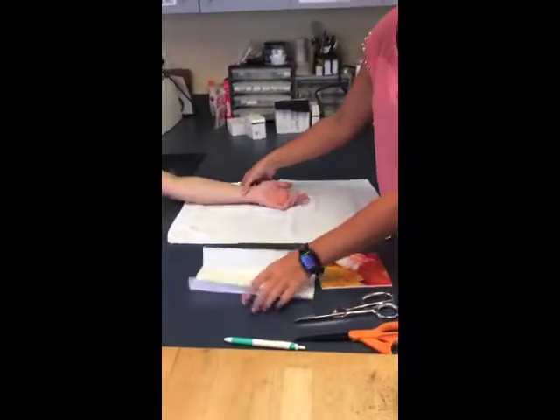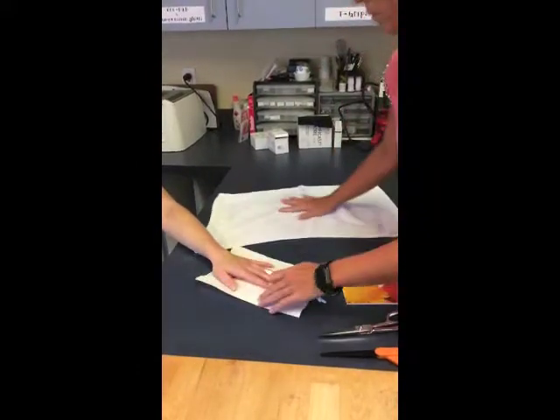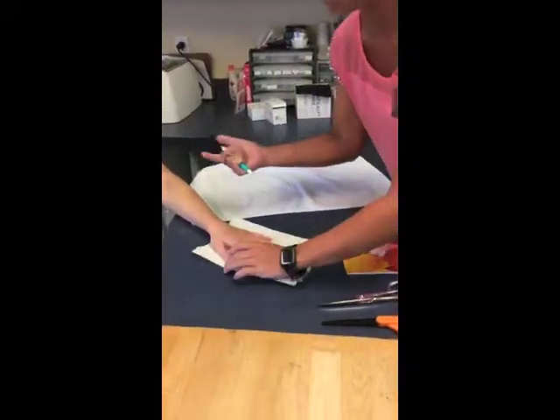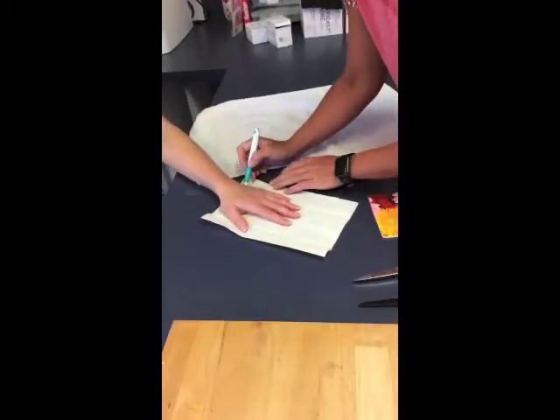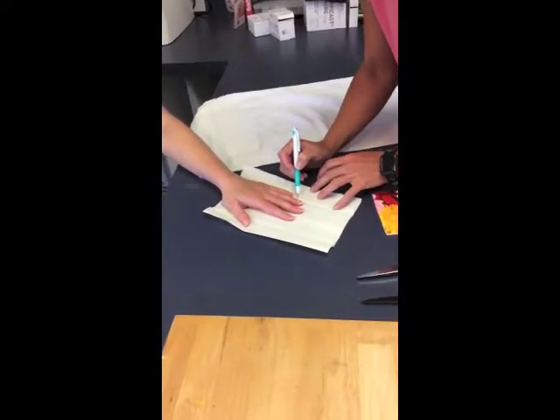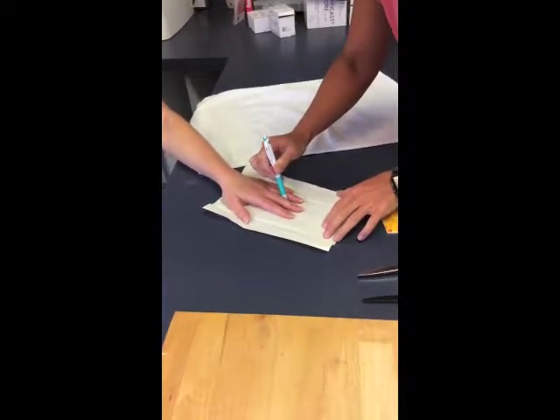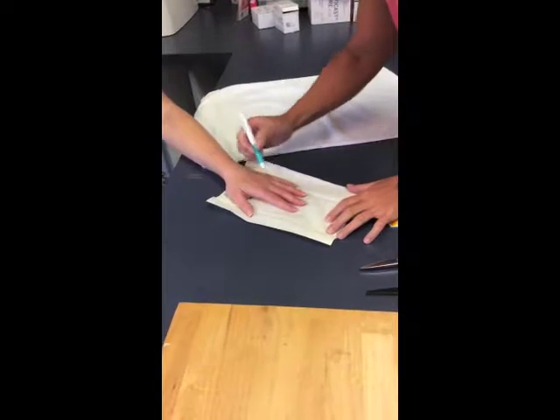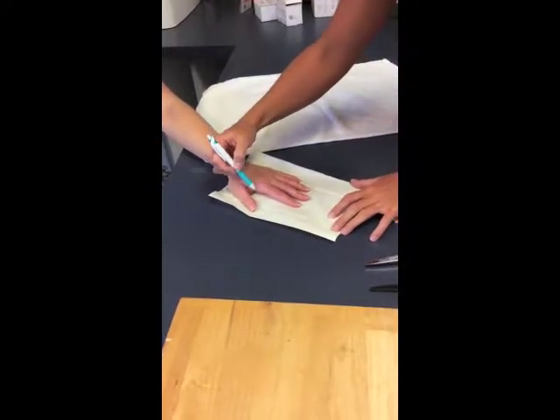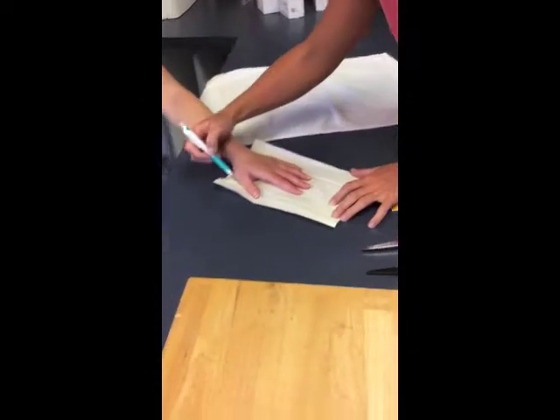First I'm going to trace the patient's hand. I'm going to stop here because these are the two affected fingers, and then it would come down to about her distal palmar crease. And then this is for the thumb.